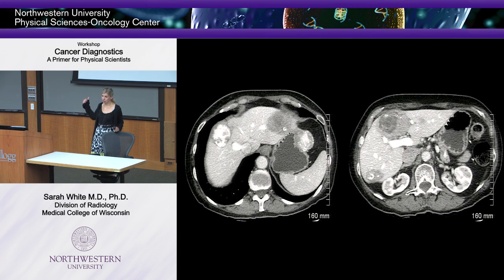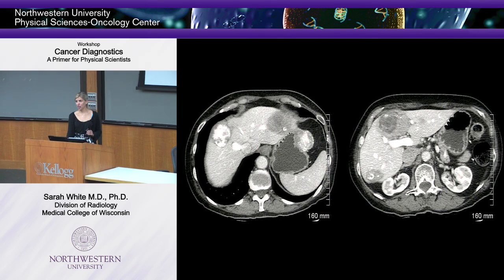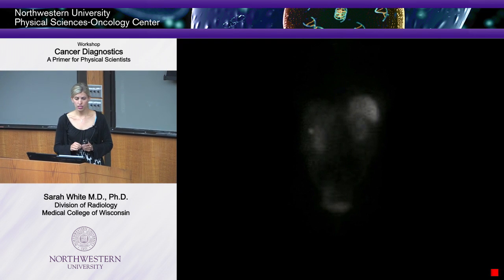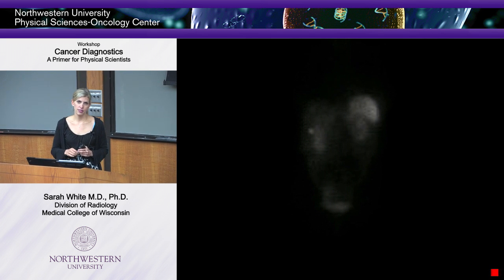Okay, when they're on the table, they're talking to me. So these patients do phenomenally well. Okay, but they have to respond, and as you've seen, some patients don't respond. So this lady was a responder, and we were really, really pleased. She went in and she had her tumors resected, and then we got this Octreoscan. Does anyone see anything? Do we win?